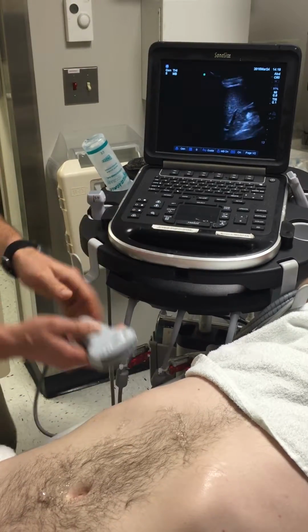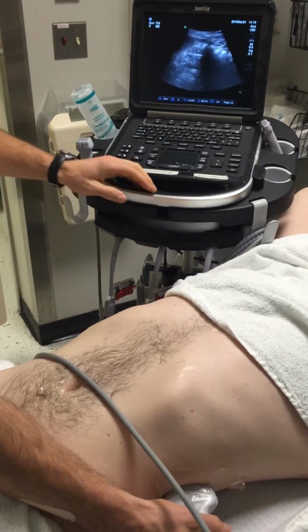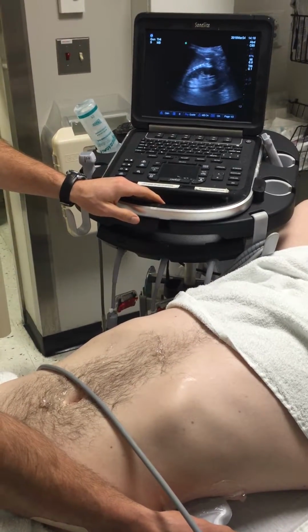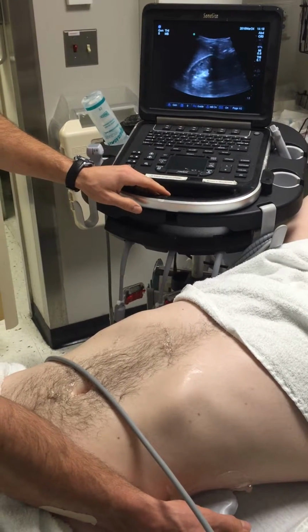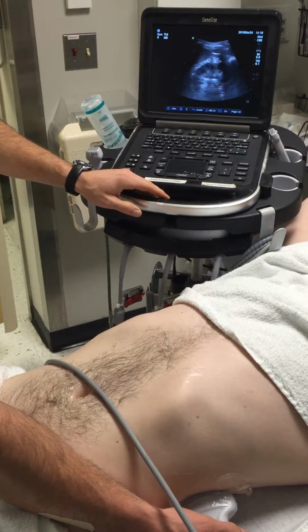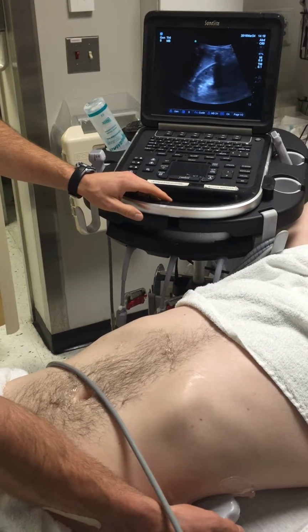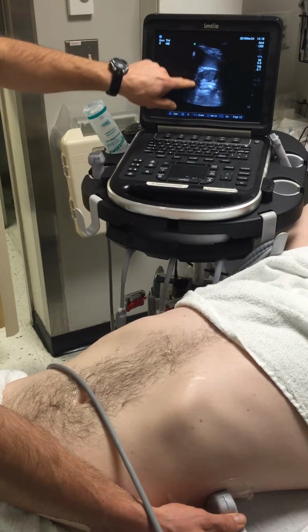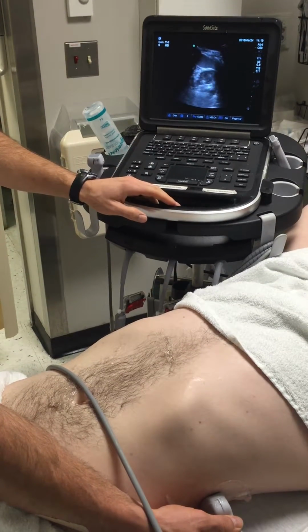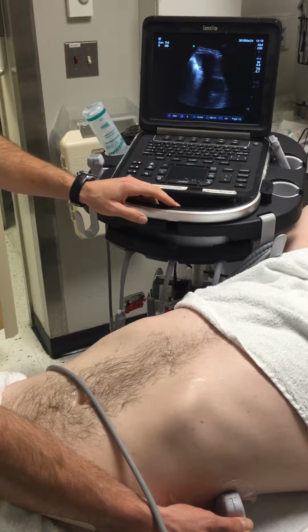Then I switch over to the patient's other side. Same thing, you start in long axis. You can see here's a nice long axis here of the kidney. You can see the cortex. And you fan through all the way. And then you turn the probe as well to get a short axis, more of a circular view, and you fan all the way from the inferior pole up to the superior pole there.